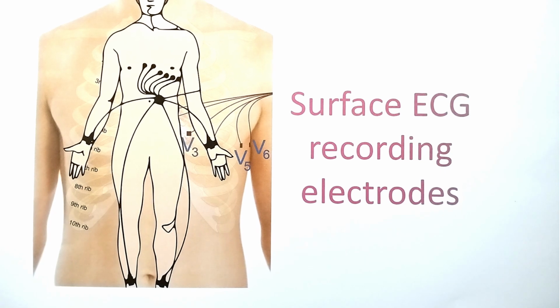The first test to assess the electrical system of the heart is not an EP study but a simple ECG, that is surface ECG, recorded from the surface of the body.